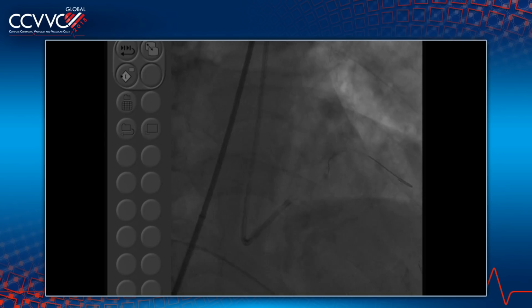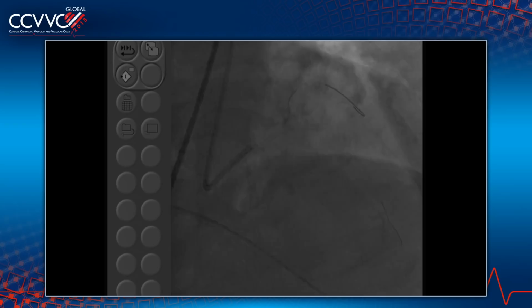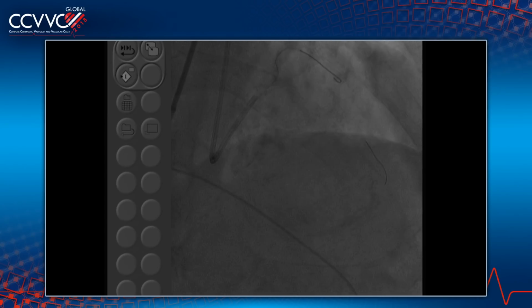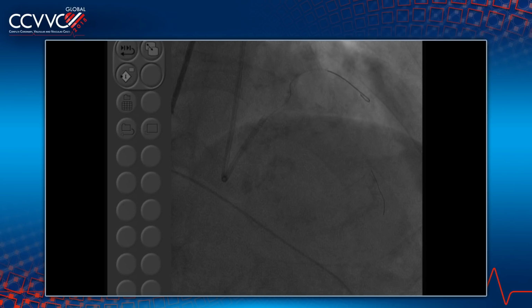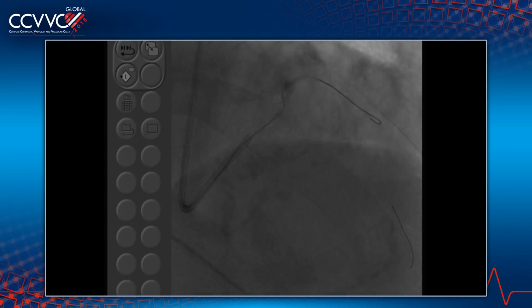It looks like you did the smaller burr into the circ, the larger burr into the LAD. All the time you're absolutely ablating the left main. And you're not concerned about closing either one of those side branches during rotational atherectomy? That is the whole advantage. That is one of the advantages of atherectomy, that it's not going to close the branch. We published on this a long time ago, but the key is that yes, you are always concerned about it, but knowing that it's very proximal, even if it goes down, we can rapidly go back in.